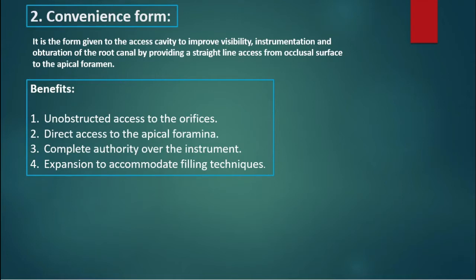Now, the second principle is the convenience form. The convenience form makes more convenient and accurate preparation and filling of the root canal. Four important benefits are gained through the convenience form modification. First of all, better visibility by having unobstructed access to the canal orifice.